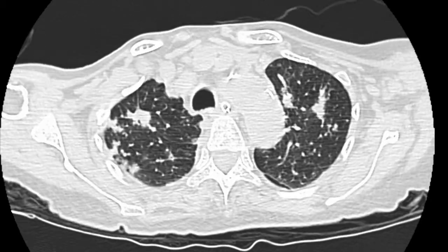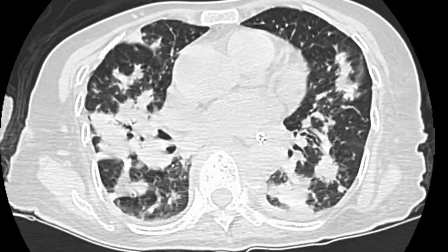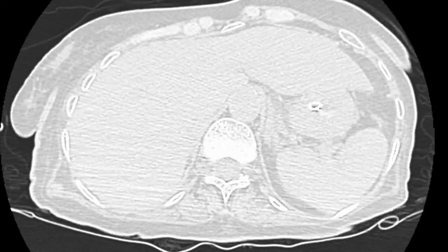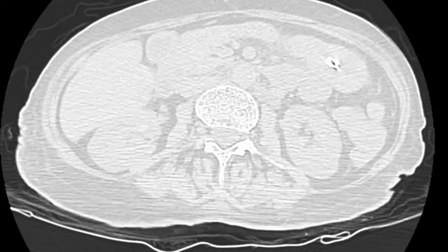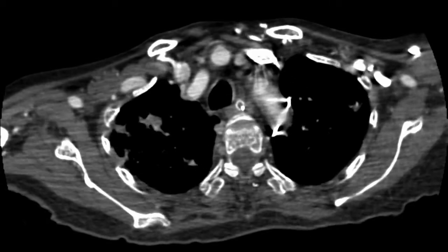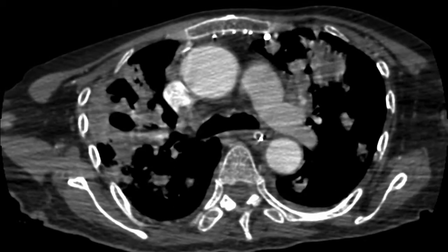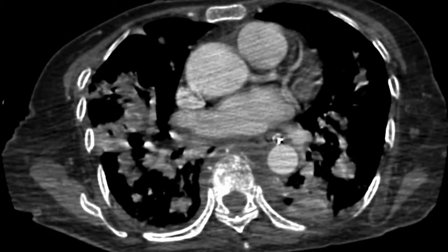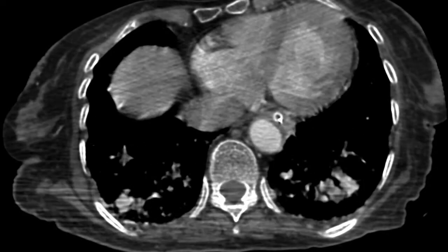We ran a CT on this patient and can see multiple fibronodular lesions scattered across both lung fields. This CT scan has almost a plethora of findings, with airspace consolidations and large cavitary lesions on the right side and areas of breakdown. Looking at the spine carefully on the mediastinal windows, we can see a collapsed vertebral body with bone destruction, as well as fairly large paravertebral abscesses on either side of the spine at this level.